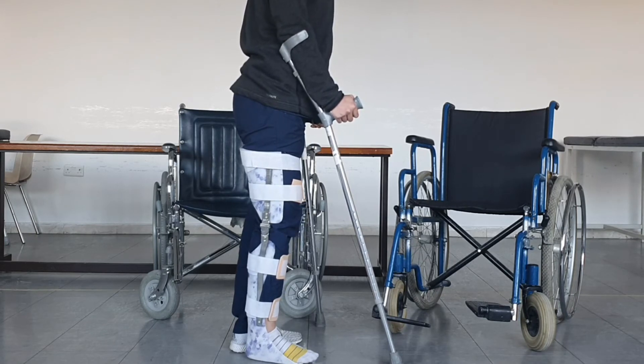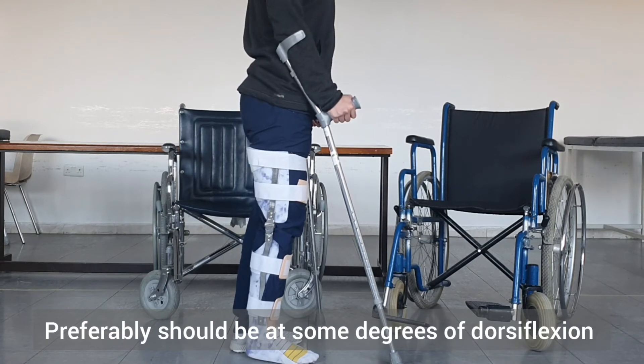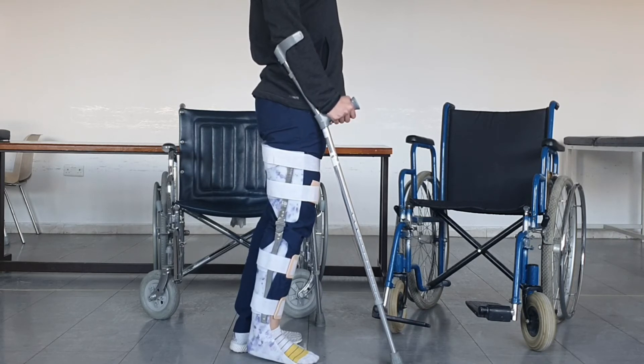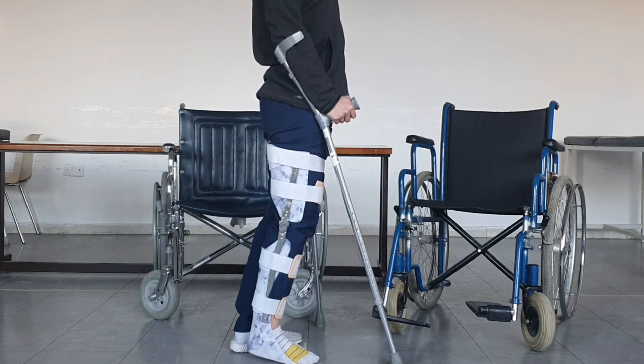For the ankle joint, preferably it should be at some degree of dorsiflexion, so when the patient stands they are leaning backwards on their hip and relying on the anterior hip ligaments to maintain stability — because most often patients will not have active hip extensors. There is also a knee hinge at the knee ankle foot orthosis.